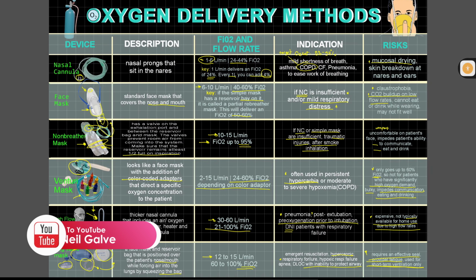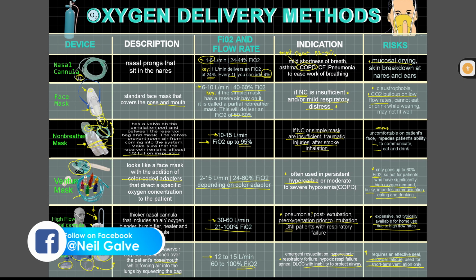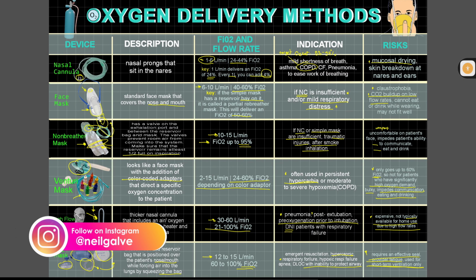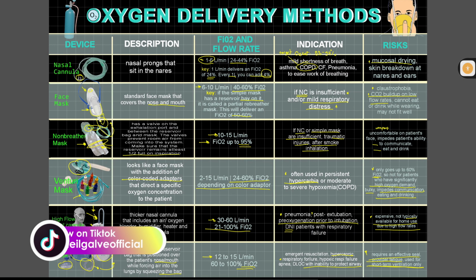So once again, this is the comprehensive list I created for you of the oxygen delivery devices that you can use for your patient. If you're working in the hospital, you're probably aware of these devices and have seen them. I suggest that you go back and check them out. Especially if you're new, familiarize yourself with how they look and where you can find them, in the event that you have to use them and want to get access to them as quickly as possible. And that ends our discussion for today.